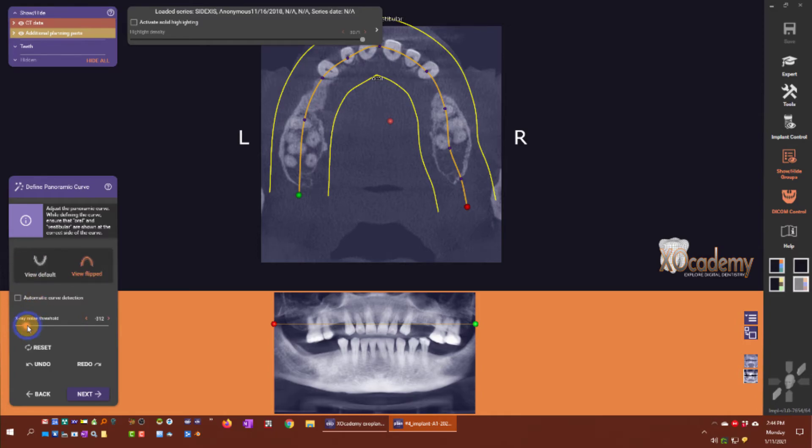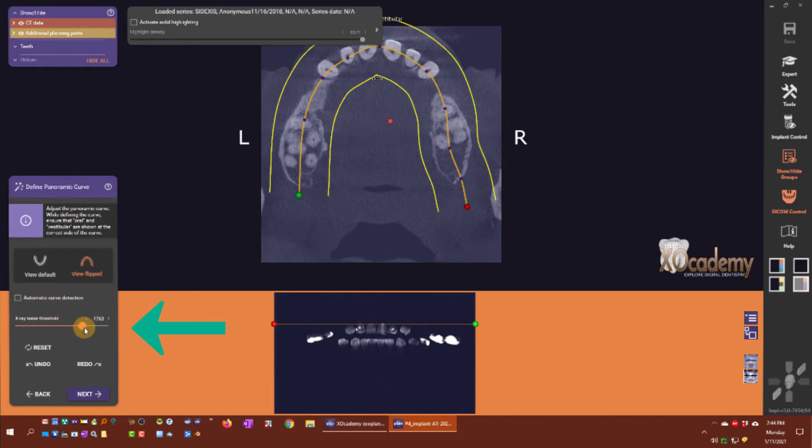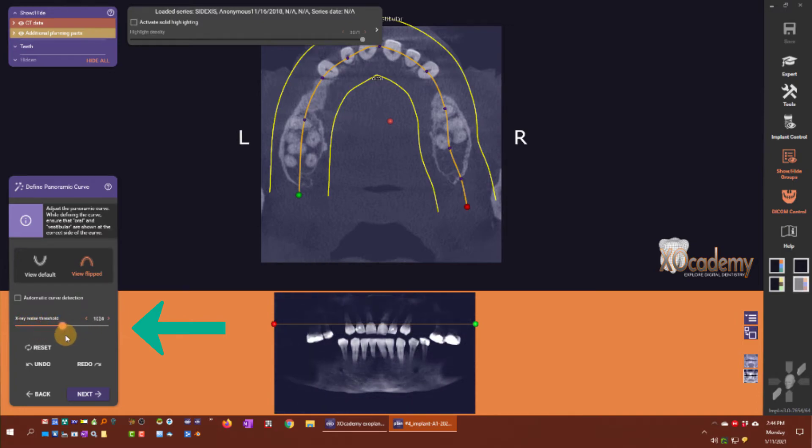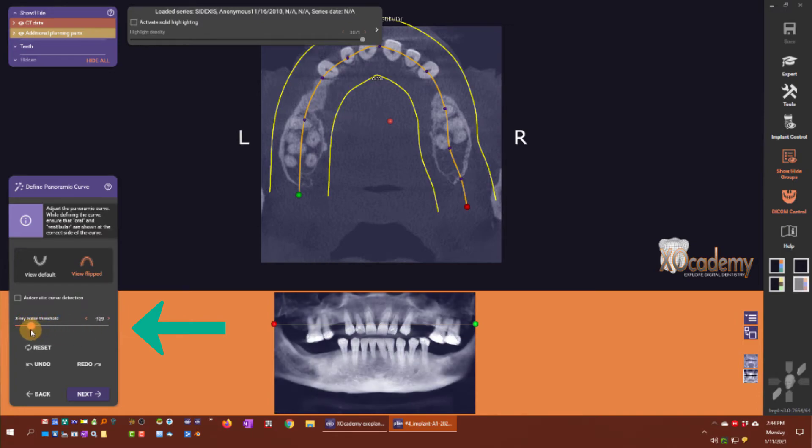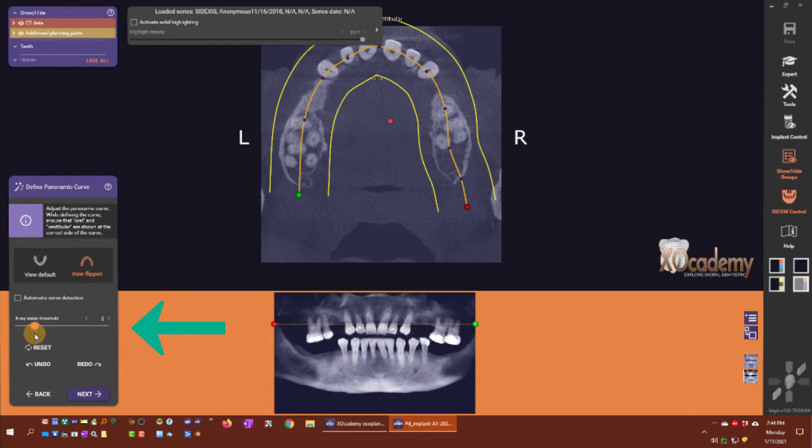You can change the x-ray noise threshold using this slider bar here. You can see it gets the panoramic composite lighter or darker.